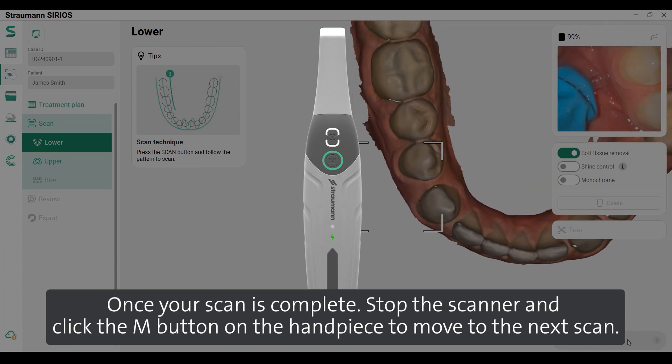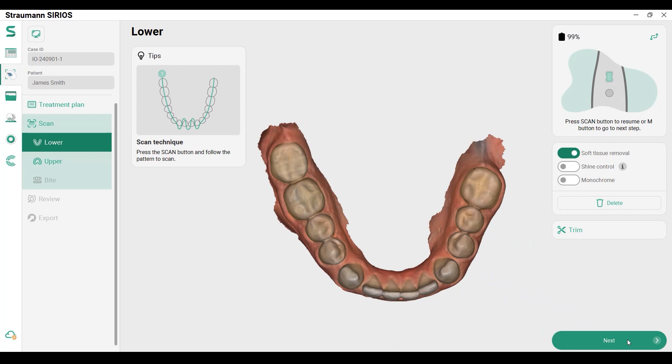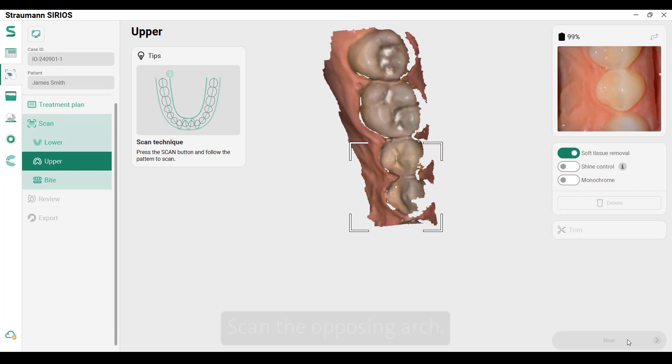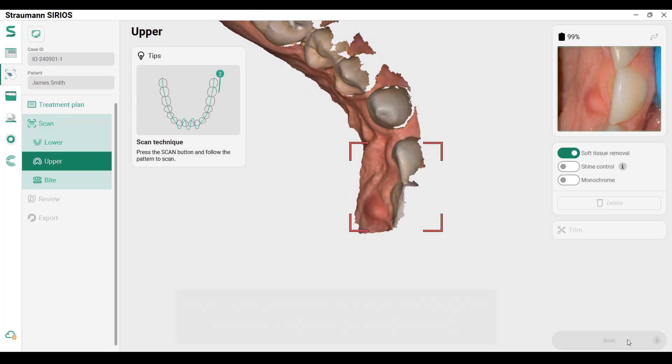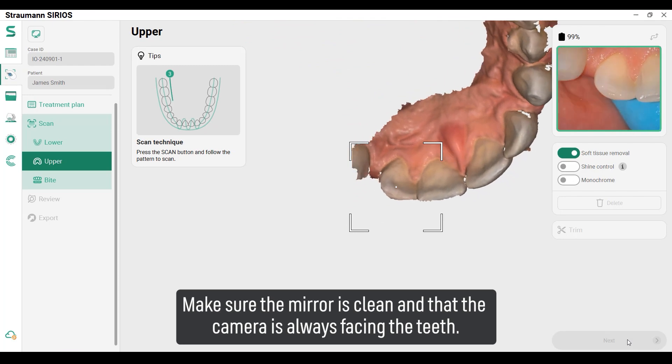Once your scan is complete, stop the scanner and click the M button on the handpiece to move to the next scan. Scan the opposing arch, making sure the mirror is clean and that the camera is always facing the teeth.